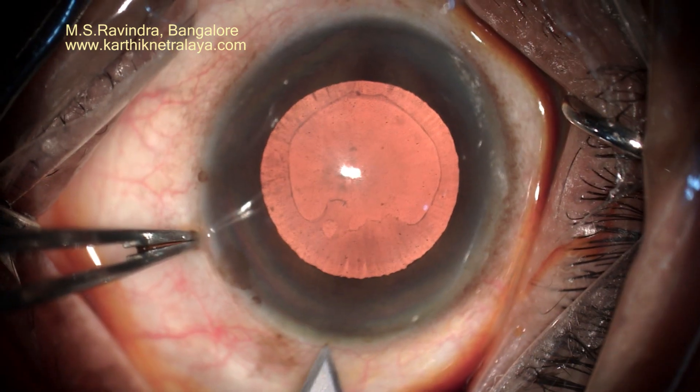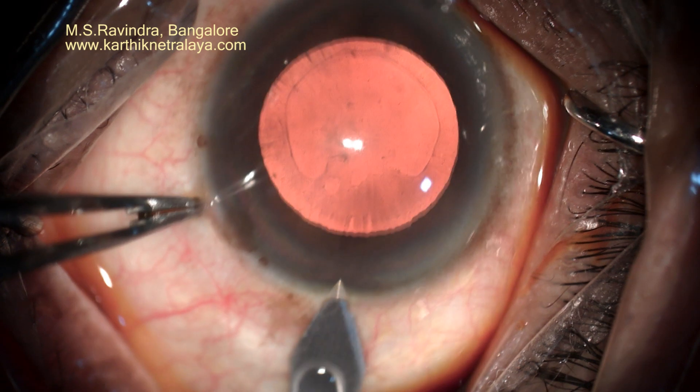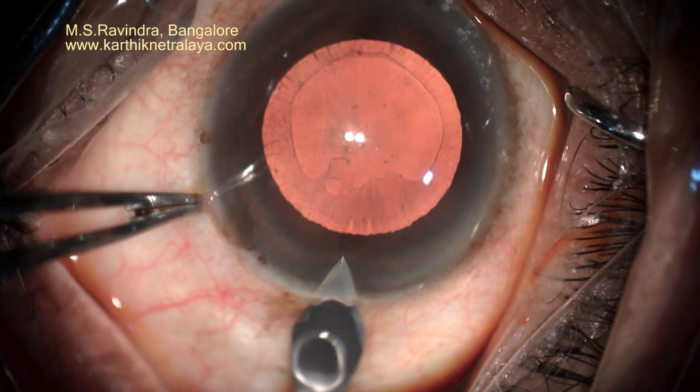Extensive pseudo-exfoliation along with cataract, and a borderline glaucoma.